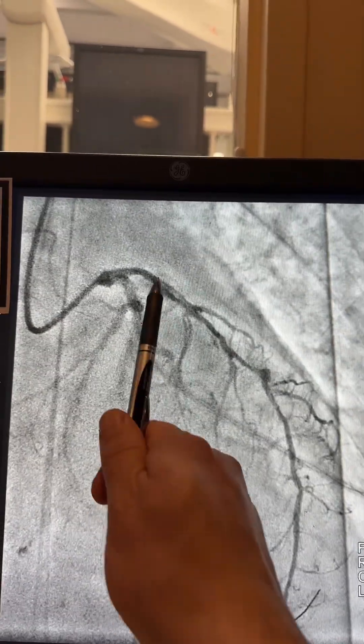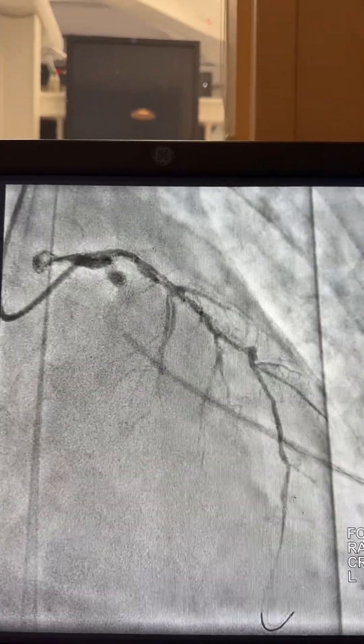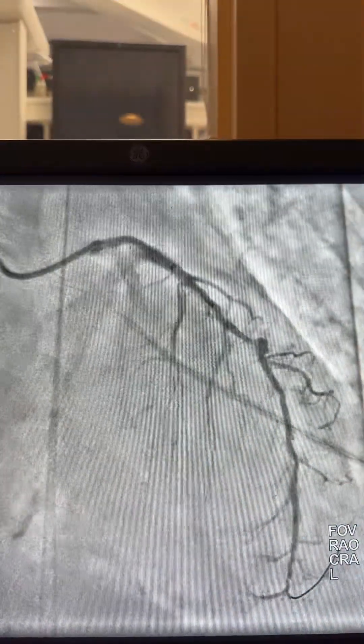Now you see the guide liner here — still have a nice pressure with some ventricularzation. Here I'm using the 2.5 shockwave balloon. After shocking the proximal and mid-to-distal segments, we now have good flow.